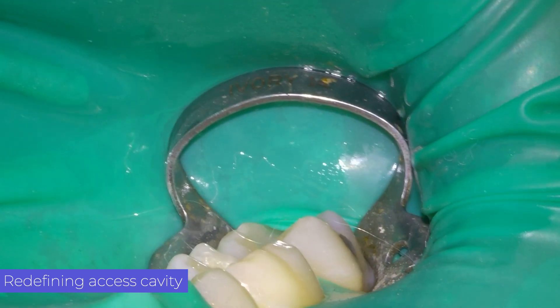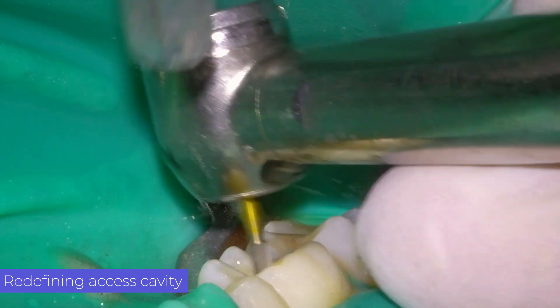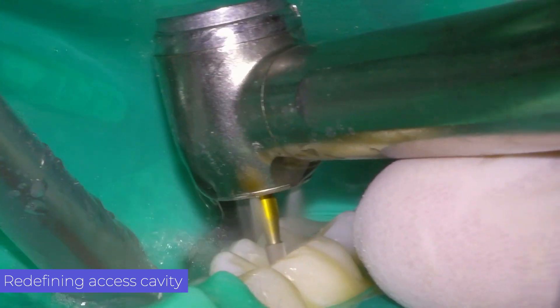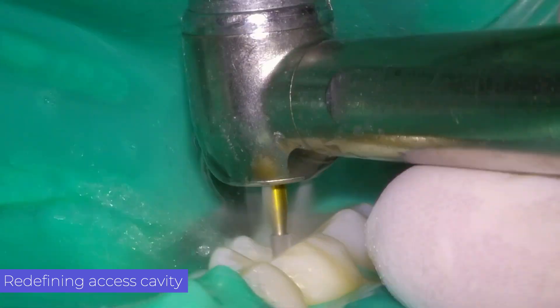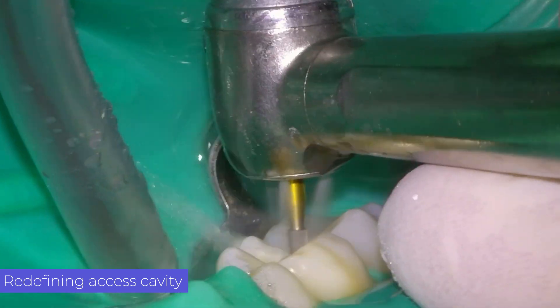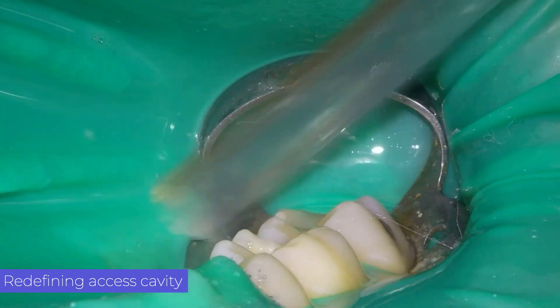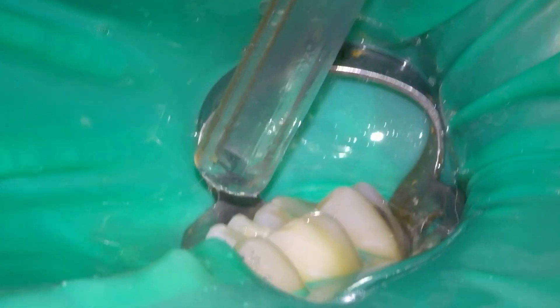Once we have located the root canals, it is time to redefine the cameral opening. In this case, we eliminate with the Ender-Z the cameral roof that remains in the lingual part of the access.